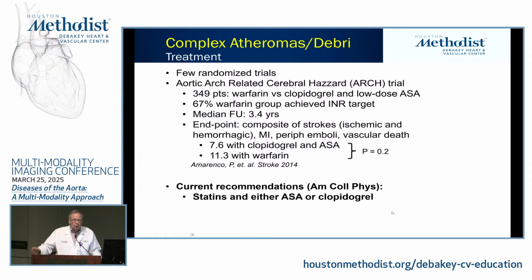So this is obviously one of the findings that we look for when we are evaluating patients with strokes. These are usually more elderly patients. And some of these aortic debris are quite interesting when you see them. As you saw in some of these examples, they can be quite mobile and funny looking, but also quite dangerous. And if you have any one of these penetrating irregular big plaques with any aortic debris in the proximal descending aorta, but you don't have it in the arch, that still can go north.